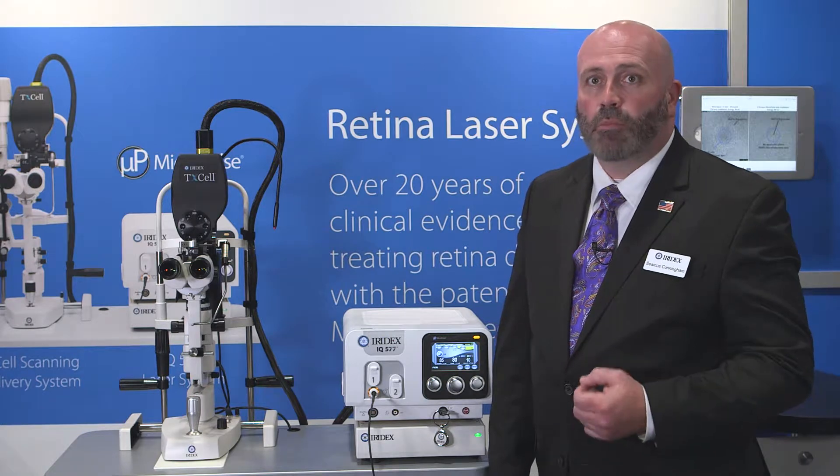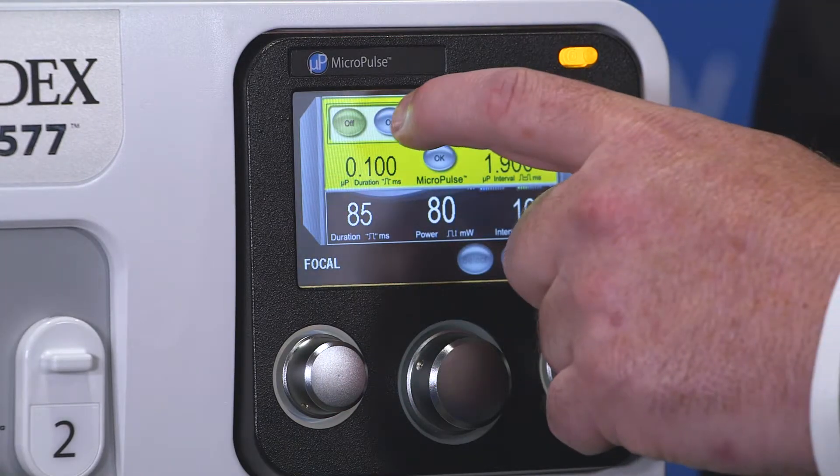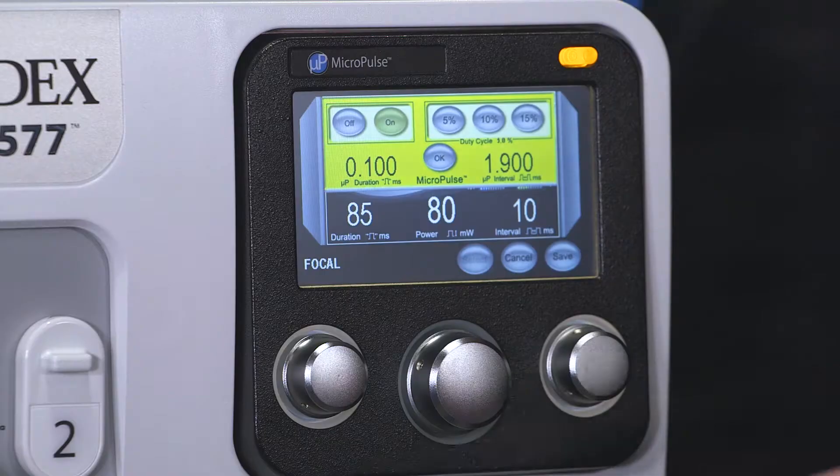The next step is selecting your MicroPulse setting. By pressing the blue icon, you can now turn MicroPulse on. You can select your default duty cycle — for focal treatments, we'll be selecting 5%. Then you can press OK.